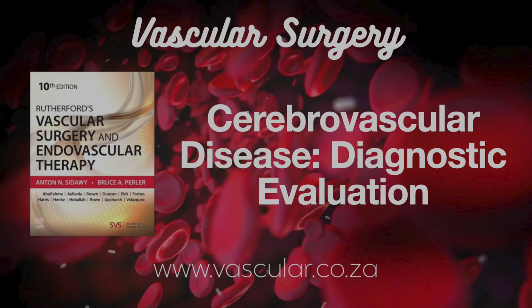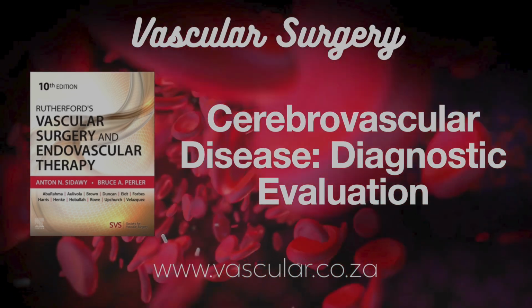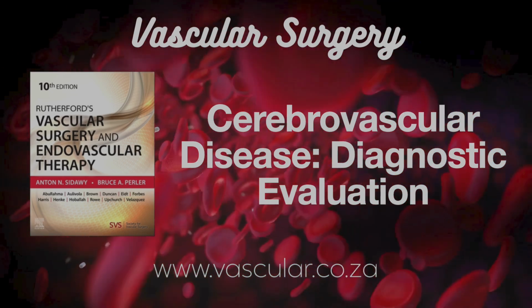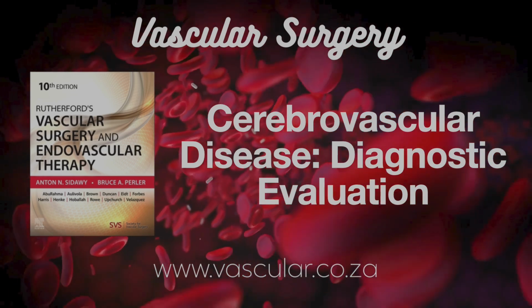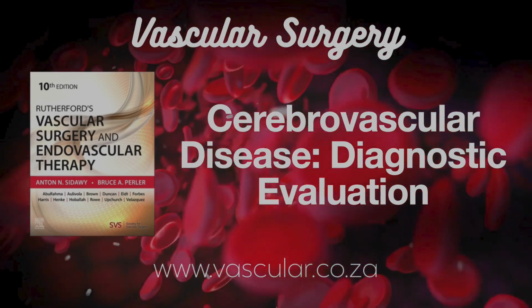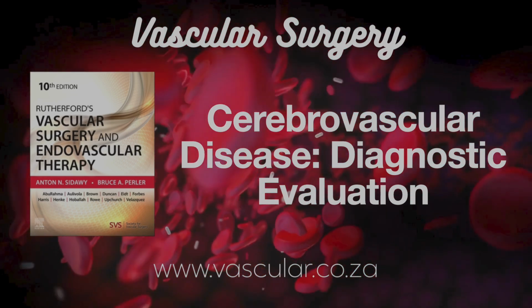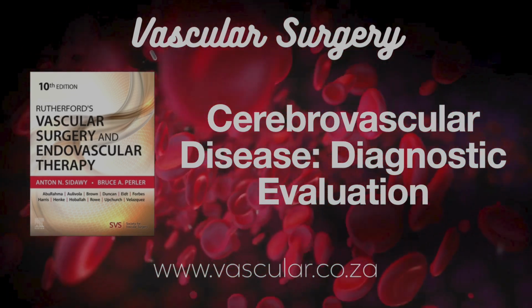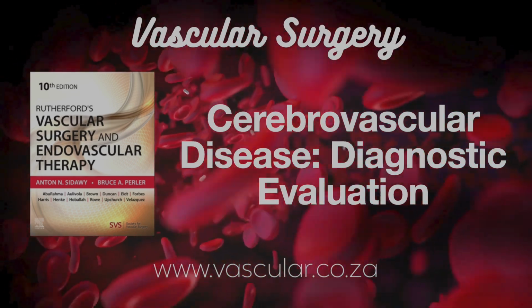DSA remains key when you suspect a more severe injury that might need immediate fixing, like a dissection, active bleeding, a pseudoaneurysm, or a clot. It allows for diagnosis and immediate endovascular treatment, like putting in a stent or coils. Makes sense. What about those carotid body tumors you mentioned, the growths at the bifurcation? DU is often great for the initial diagnosis. These tumors typically cause a very characteristic splaying or widening of the fork where the carotid splits.